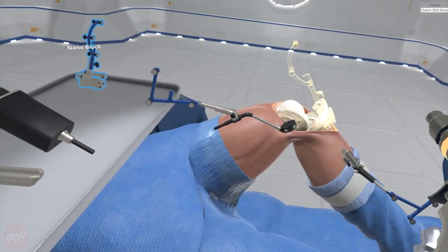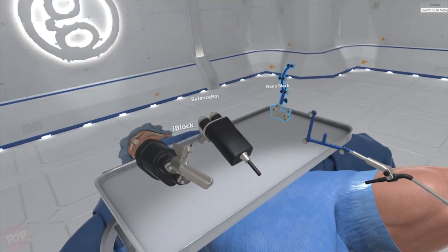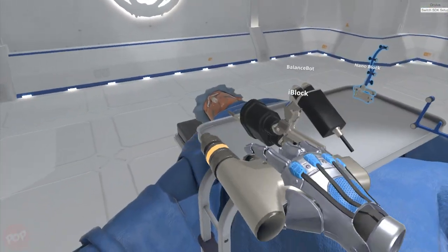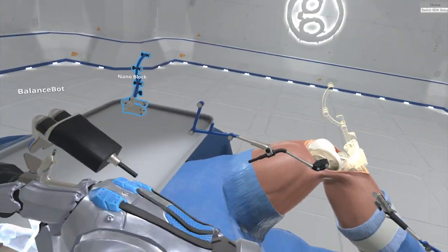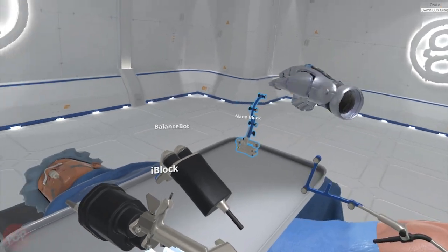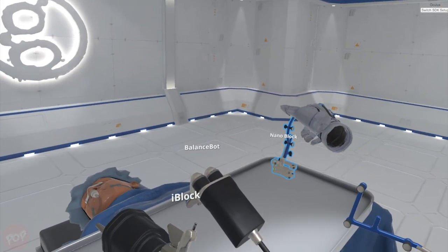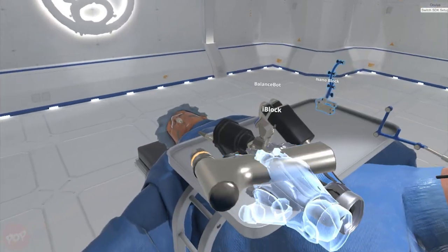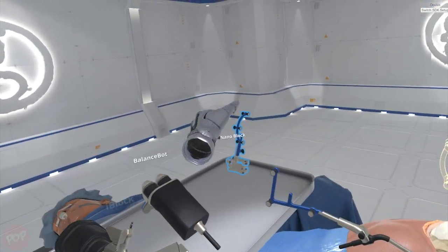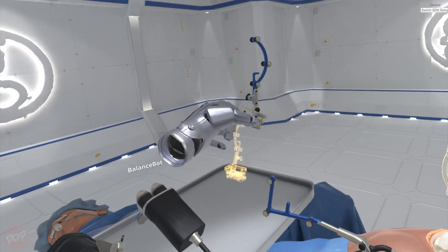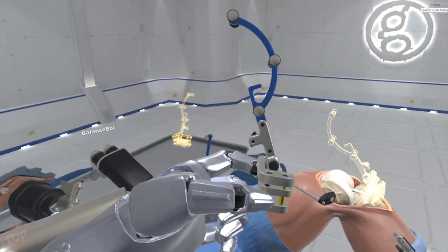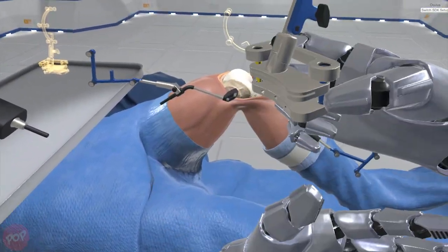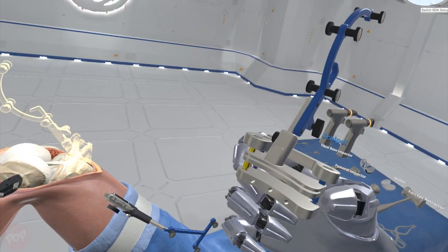Select the nanoblock. The nanoblock will guide the tibial resection. Position the nanoblock over the tibial tuberosity; the target array assists in placement.